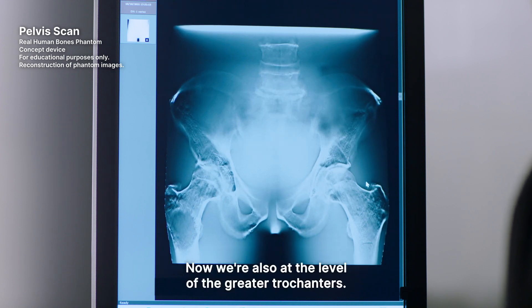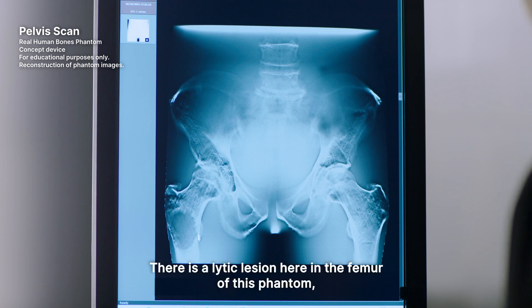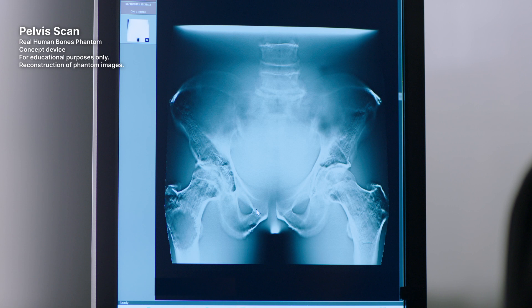Now we're also at the level of the greater trochanters. There is a lytic lesion here in the femur of this phantom, and we can see very nicely the trabeculae of the proximal femurs.